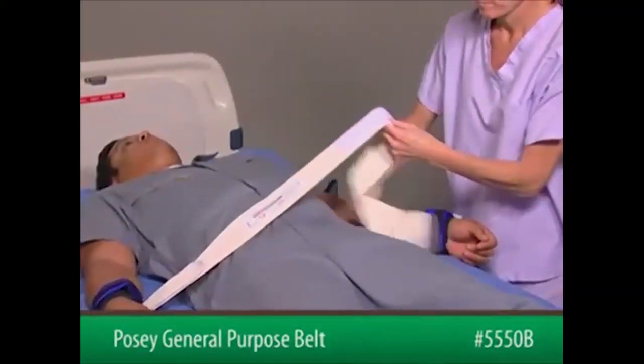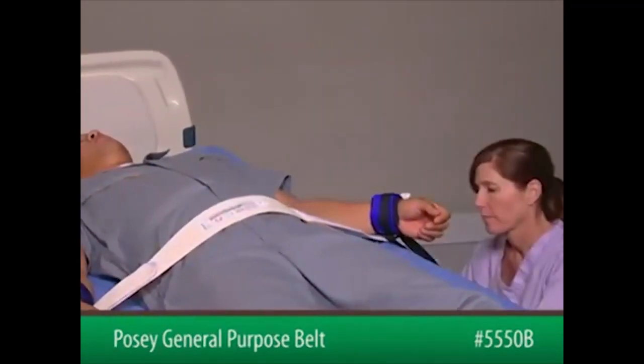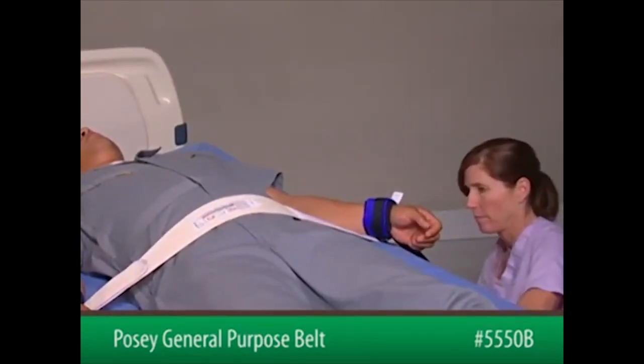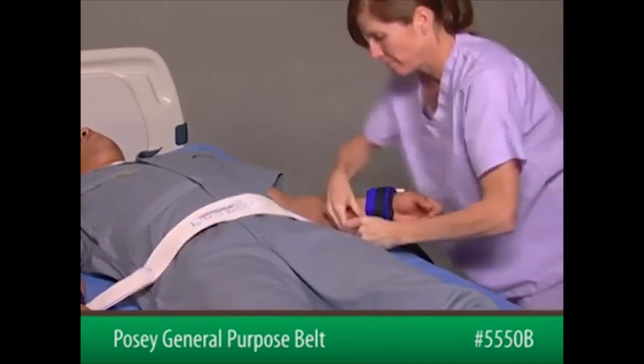Now, place the belt across the patient. Bring the ends of the strap down through the inside of the side rails around the frame and connect the hook and loop together firmly, and check to make sure it adheres securely.